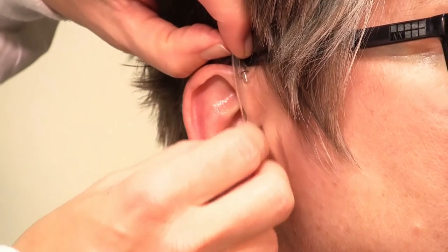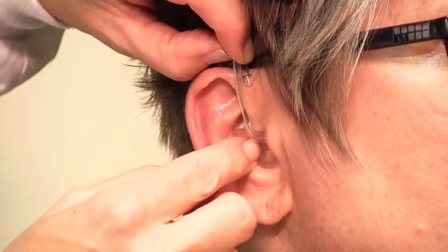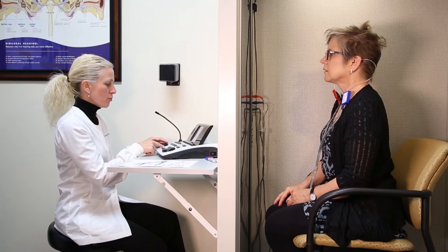Mark it with your fingers so you know where you need to trim the tube. When I have reached an uncomfortable level for pure tones.